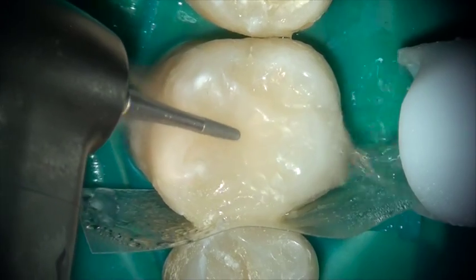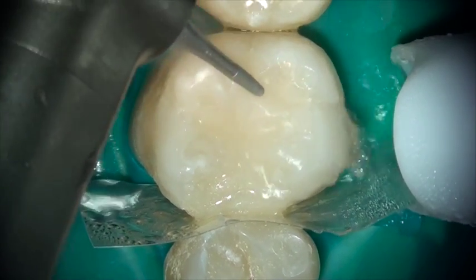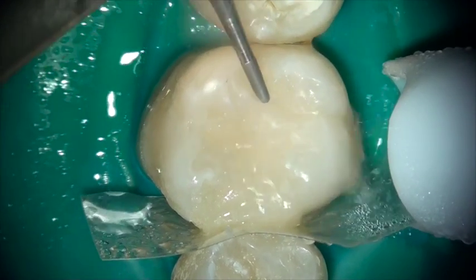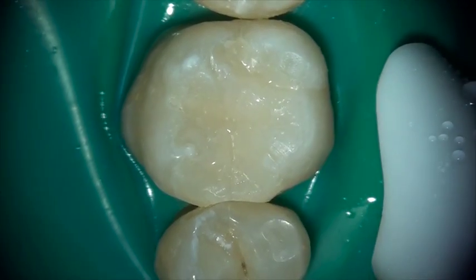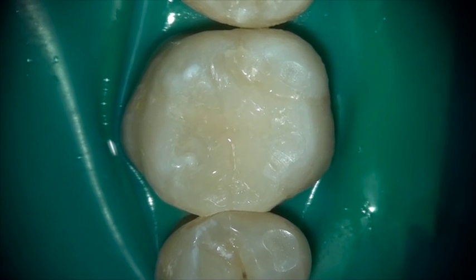And this material, once set, is beautifully finished using a relatively low RPM handpiece with ultra-fine diamonds. So you have an amazing, self-polishing restoration in your hands.